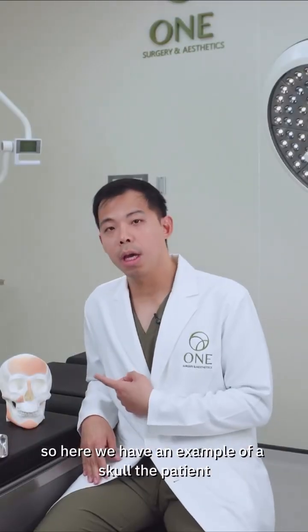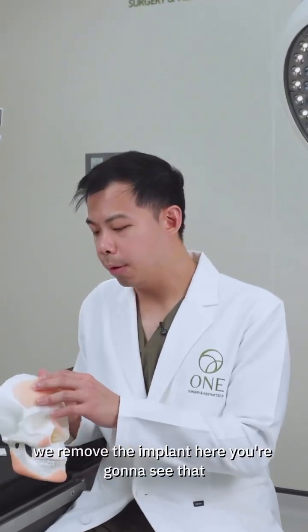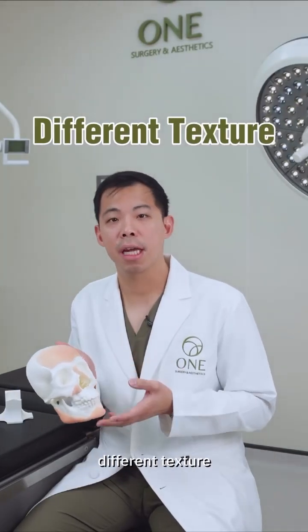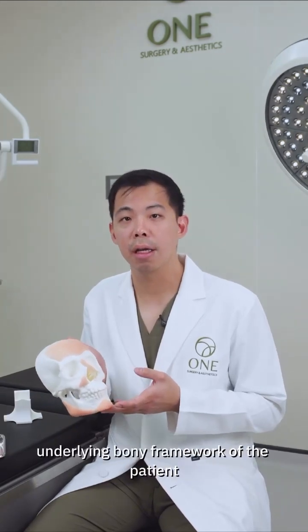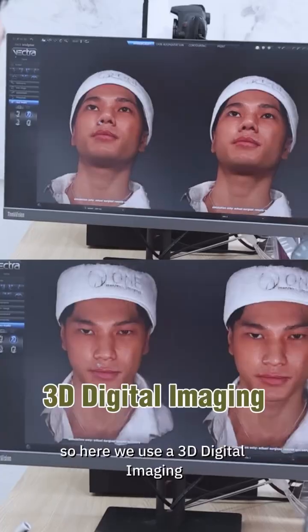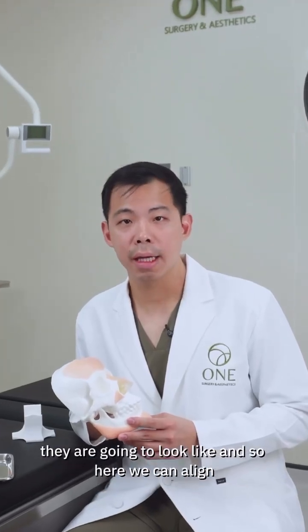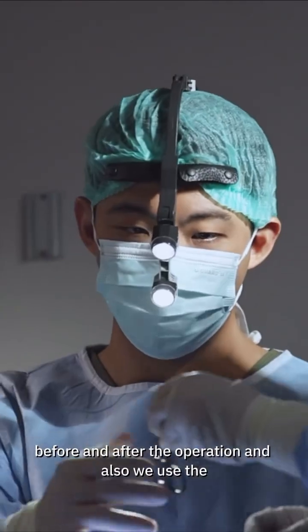So here we have an example of a skull of the patient. As you can see here, if we remove the implant, you're going to see that the skull of the patient has different texture from person to person, and there's a lot of variation in the underlying bony framework of the patient. So here we use 3D digital imaging to let the patient see what they are going to look like after the surgery. And so here we can align the expectation of the patient before and after the operation.